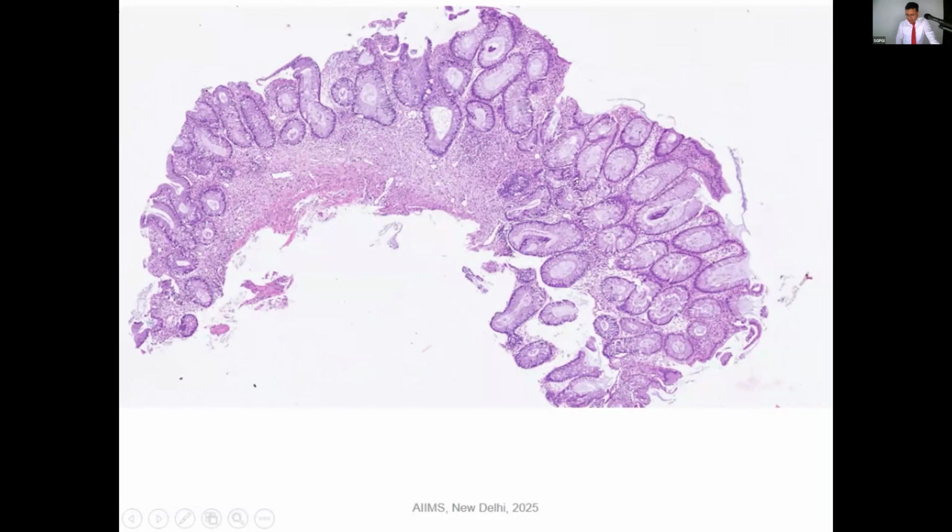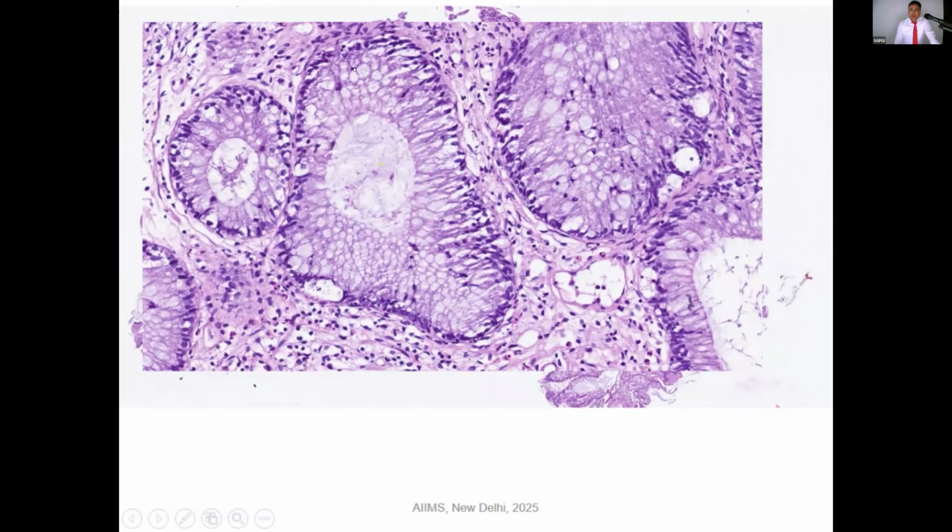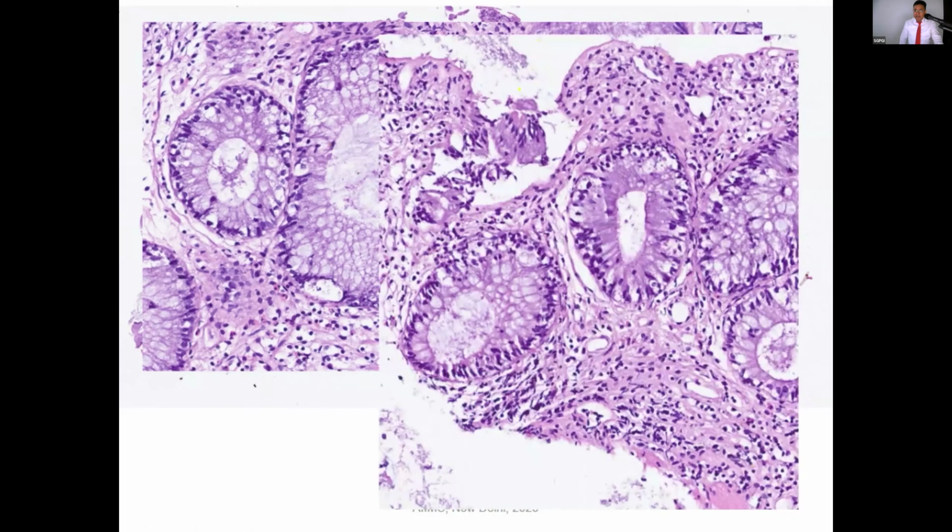There is not many eosinophils. But what we identified, all the crypts are showing prominent lymphocytic infiltrate as well as there are apoptotic bodies. Can you identify this? So, we asked the clinician if there is any history of immune suppression or transplant. It was not. It was discussed in the MDT, but these features were very prominent, unlike conventional IBD.